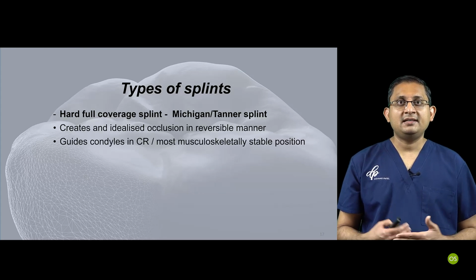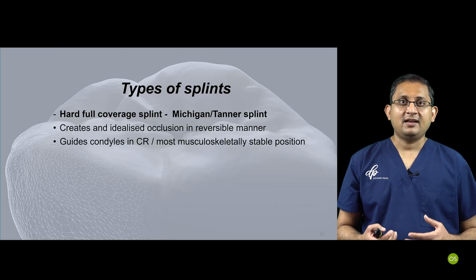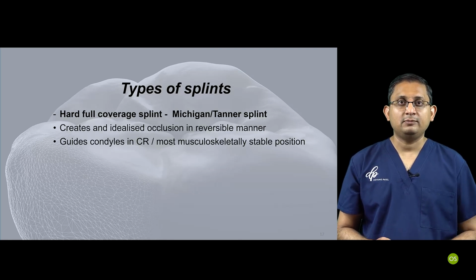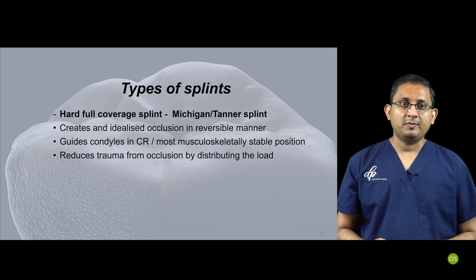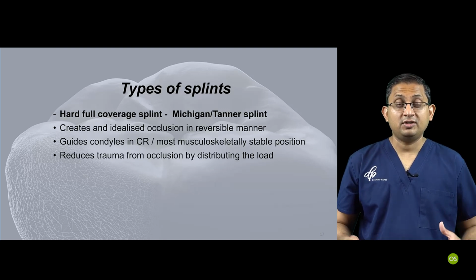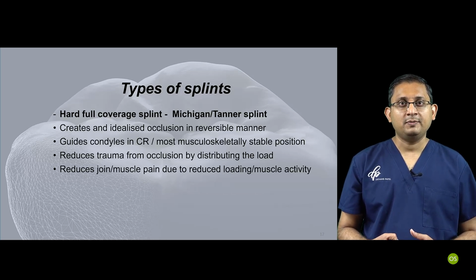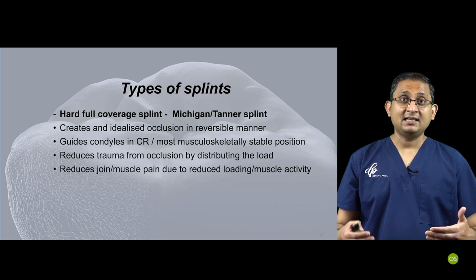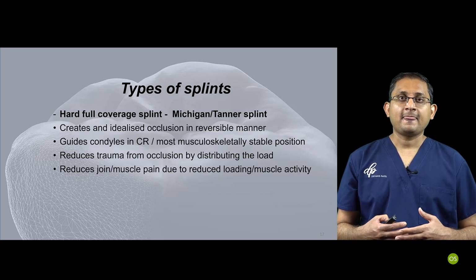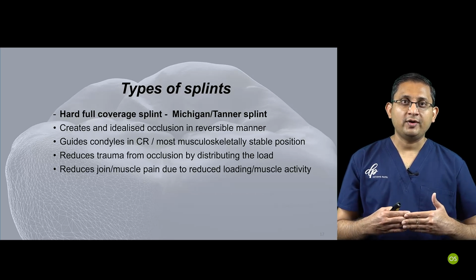It guides the condyle in CR, again in the most musculoskeletally stable position, and that can help you in mounting your model or relieving the pain. It reduces the trauma from occlusion, as we discussed, by redistributing the load. It reduces jaw joint and muscle pain, again because of the distribution of the load, and because it has a guidance built anteriorly, it moves the forces away from the joint.